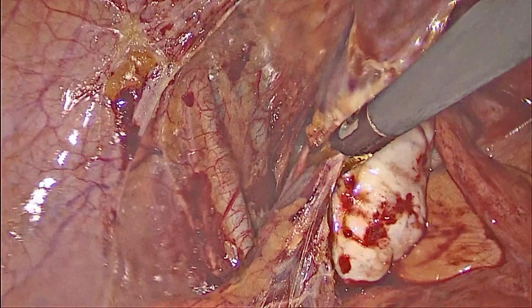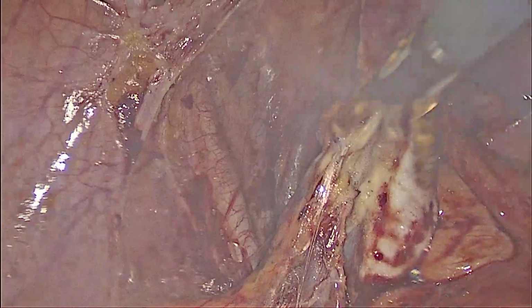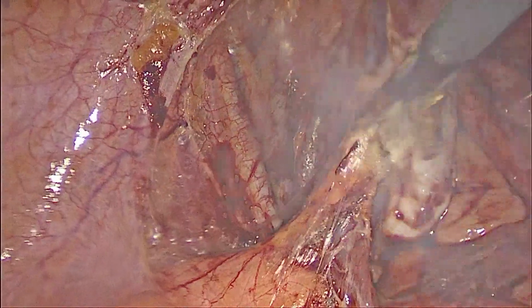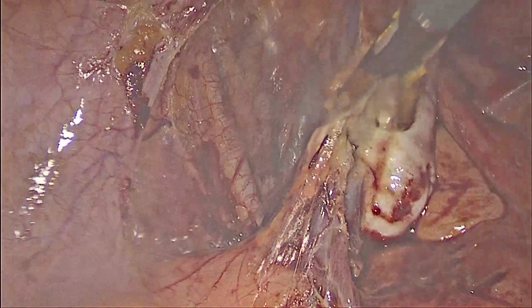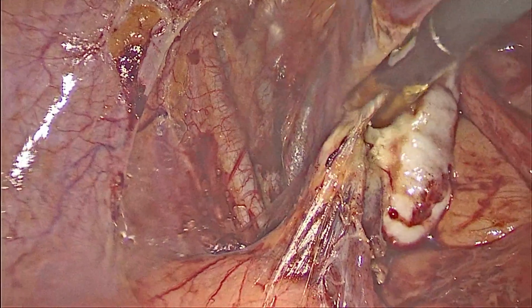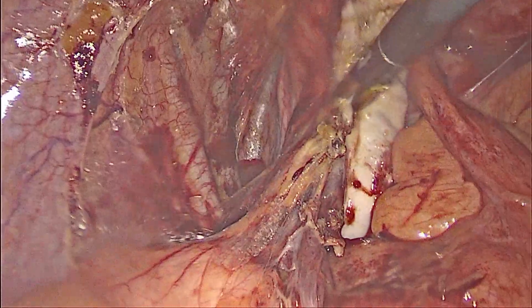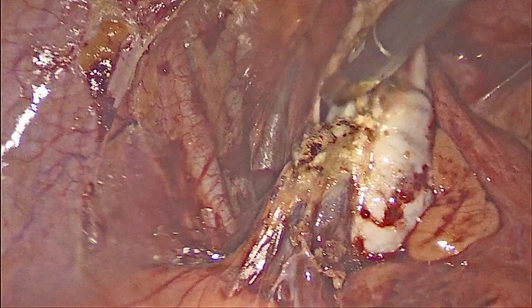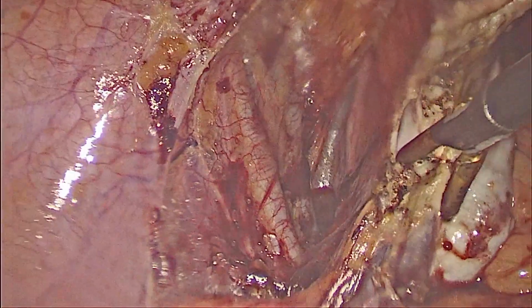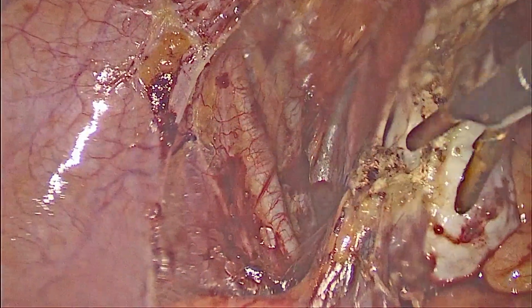Now we can divide the infundibulopelvic ligament after coagulating it completely. So that is a complete division of the infundibulopelvic ligament.